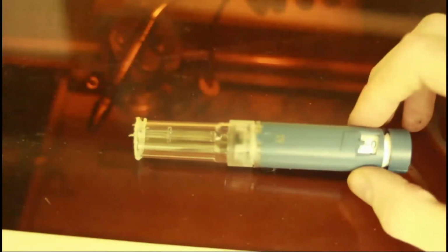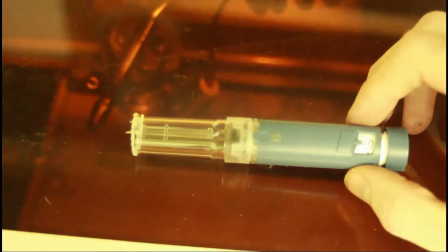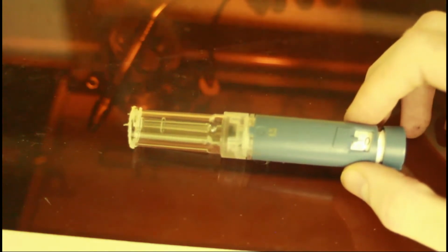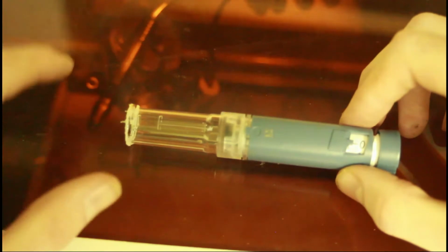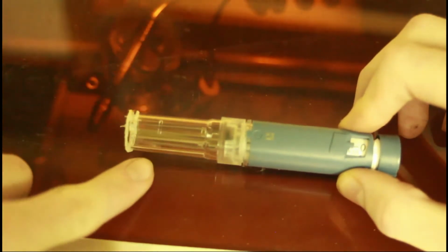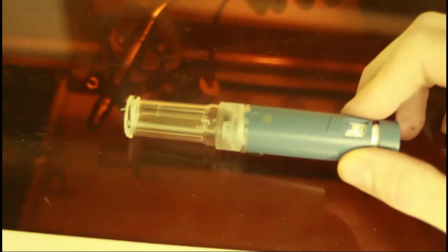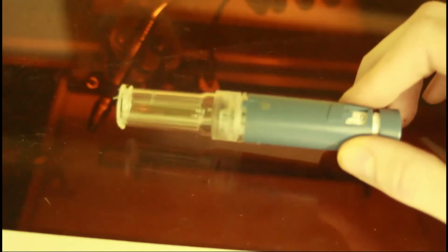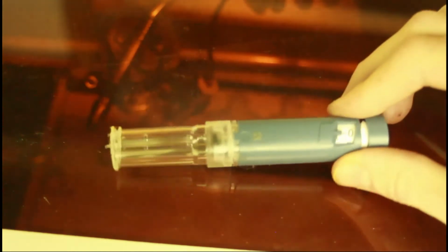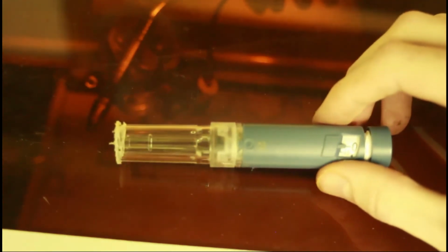Safety first. So the first thing we're going to do is take this pen base right here that we burnt the vial out of, and we're going to use a laser cutter to cut it at just the right length to where a syringe is going to fit in it at just the right space. The reason we're using a laser cutter is we need the mathematical precision of it in order to make the syringe fit just right. We can't have it loose at all. So I can't just do this part with my hands. Let me show you how it's done.